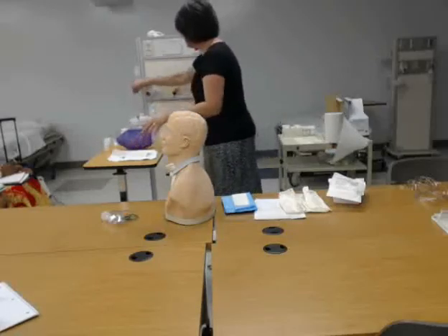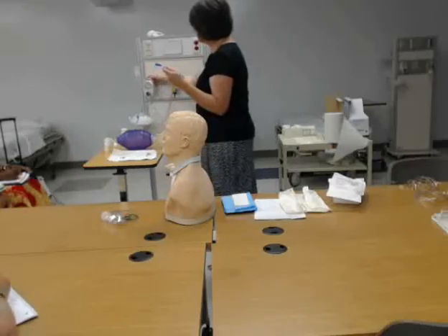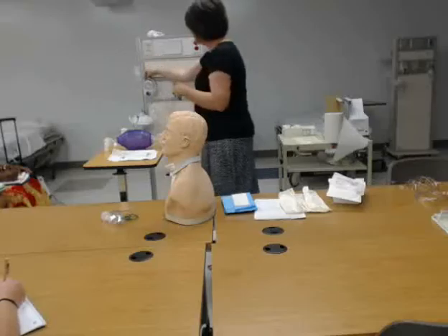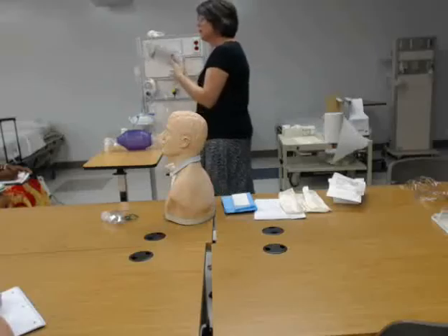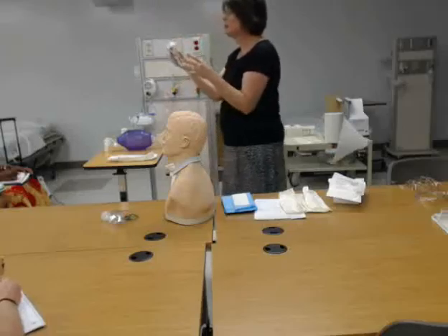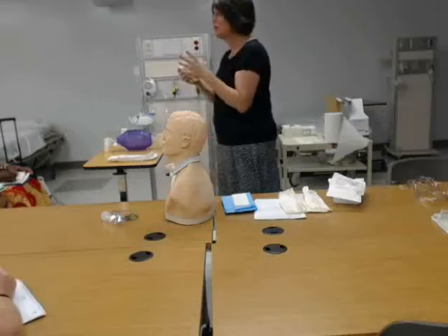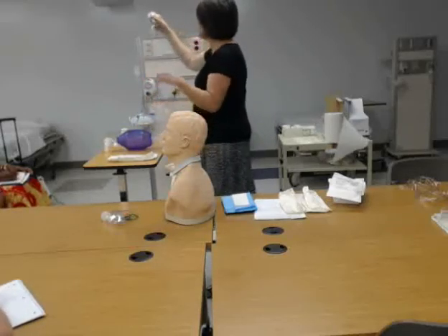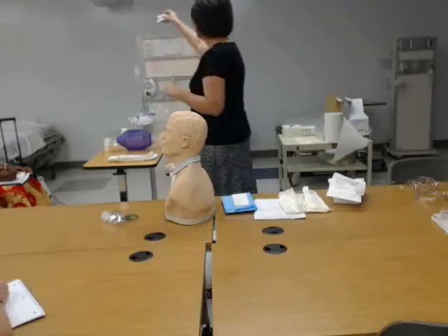They should have working suction. This is our suction machine. We can check that it's working by putting it over to regular, which is continuous suction, and just checking it. There should be at least one, if not more, suction catheter kits in the room. And then also we want a spare tracheostomy. It's usually still sterile, all wrapped up in a box, and it's usually taped above the head of the bed. You've got to make sure you're looking for your emergency equipment.